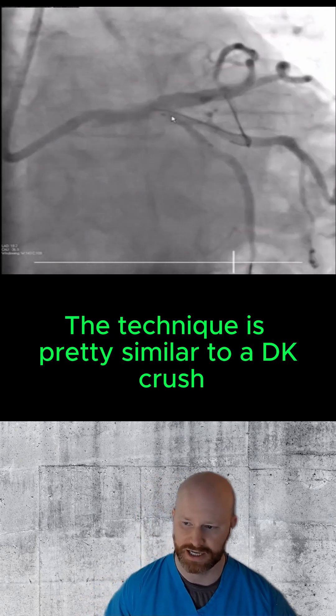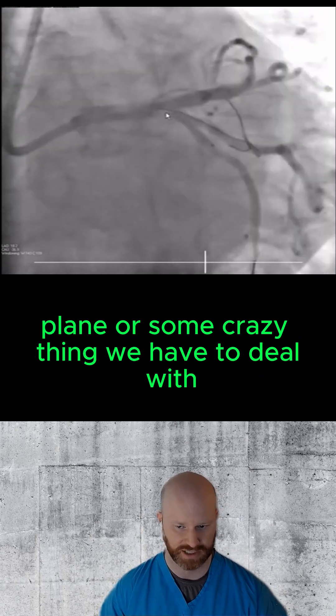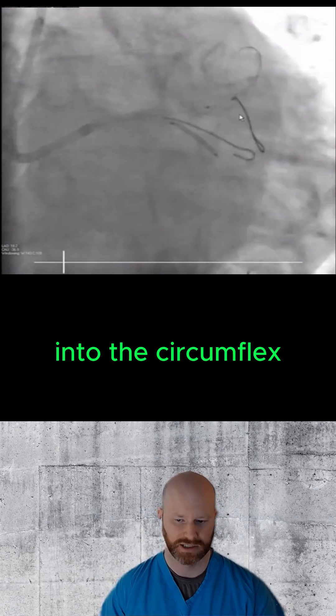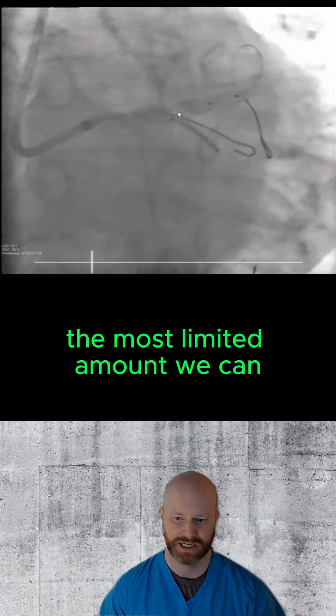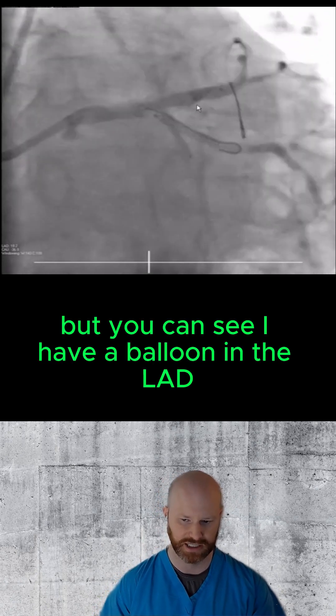The technique is pretty similar to a DK crush. We secured the mid vessel so we don't have a big dissection plane or something we have to deal with. What we're going to do is put a stent into the circumflex, extending it back to the left main, but the most limited amount we can. I have a balloon in the LAD that's distal.